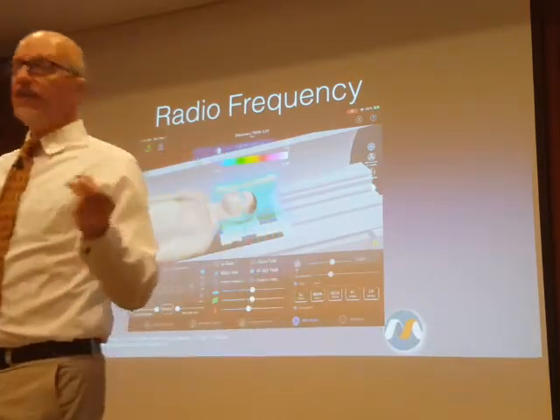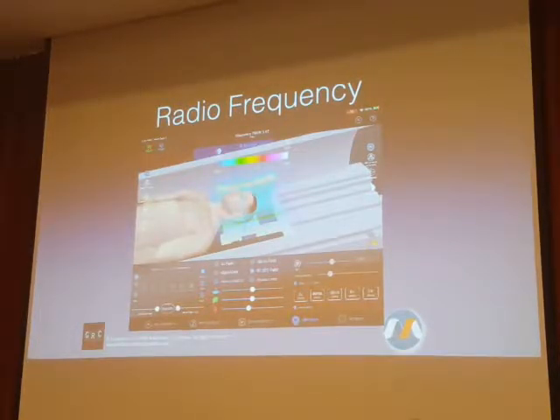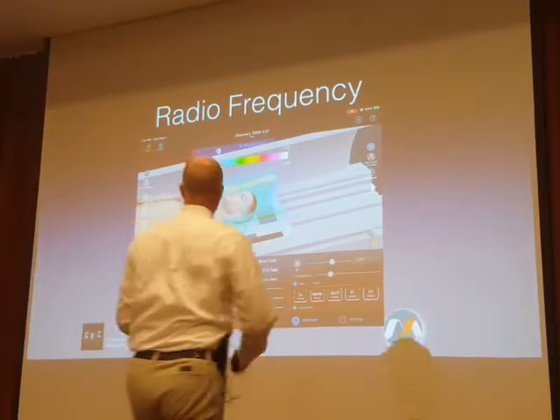If you can't see the anatomy expanded to the maximum possible field of view, the reason you can't see anatomy is because there's no signal. The reason there's no signal is because there's no radiofrequency energy incident on those tissues. Max your field of view on a transmit-receive coil, and where you see anatomy is where that patient is getting radio frequency energy. Where you don't see anatomy is essentially where there's too little radio frequency energy to produce any meaningful signal. So that gives you a pretty effective map.